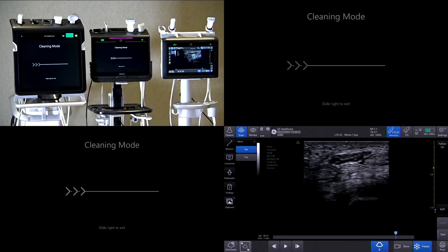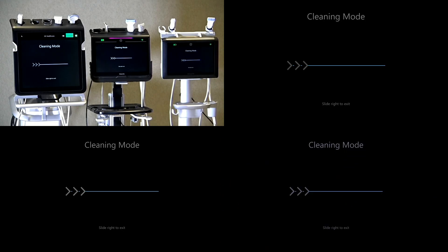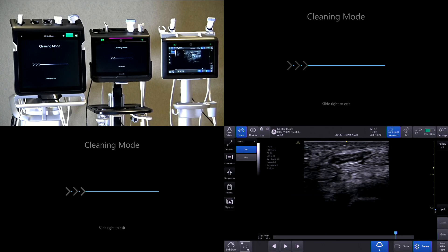All three systems were engineered with a seamless flat display for easy cleaning. To allow cleaning of the touch panel display without affecting the system operation, tap Settings, then tap Clean. Swipe to exit. For a complete list of approved cleaners and disinfectants, visit GEHealthcare.com.